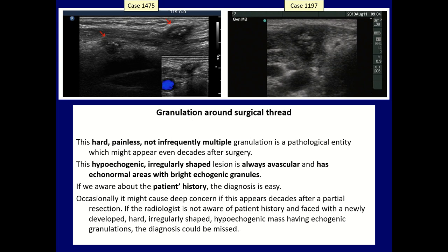The last figure is indeed not an intranodular echogenic figure, but I mention it here. It has a very special appearance — this granulation around surgical thread. It can appear even decades after a surgical procedure. This is characterized by a hypoechoic mass with irregular shape. It is always avascular, and within this hypoechoic background, we can see echonormal areas with bright echogenic granules.